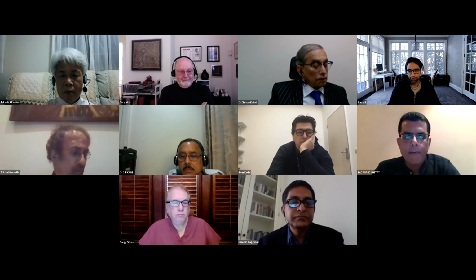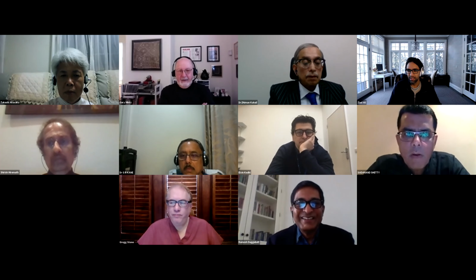So first, since we can speak openly amongst friends, I think that laser utility for debulking of neointimal hyperplasia is a complete load of hooey, is the better way to say it. Or Gary would say it even better. What would Gary call it? It's just total nonsense. There is no evidence to suggest that is the case. And remember, the laser basically emits perpendicular to one side of the catheter, so it's not ever impacting 360 degrees of the artery wall. So first of all, for debulking of neointimal hyperplasia, it's nonsense.